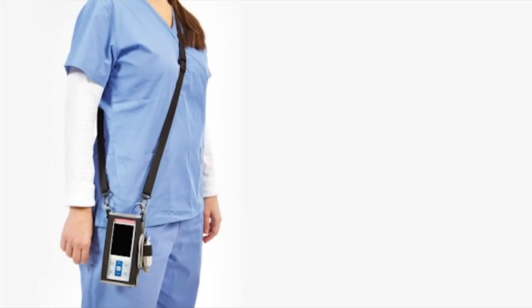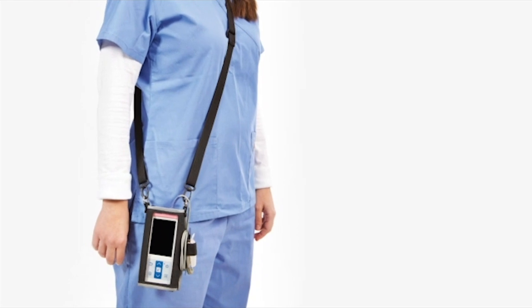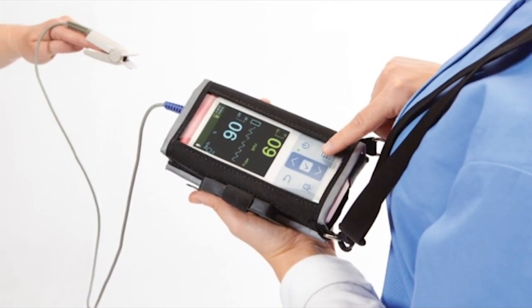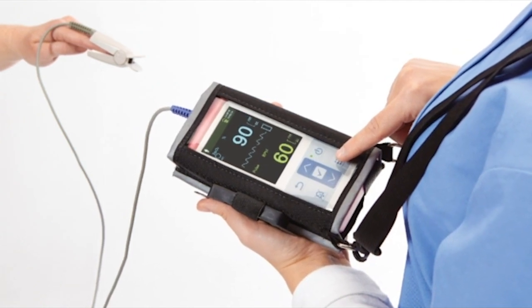The monitor incorporates Nellcor digital signal processing technology to deliver accurate, reliable SpO2 and pulse rate values even during low perfusion and signal interference, including patient motion.